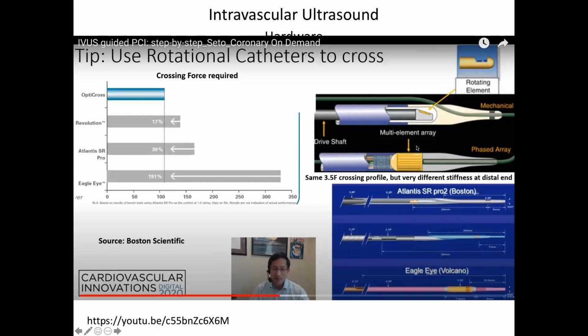And so here's 2 types of these catheters. One is you essentially have a fixed phased array of transducers that are on a cylindrical orientation, and you'll make pictures. You'll just go round and round that cylindrical orientation. And this is a more original way this was done, is that a motor just spins an inner drive shaft upon which the ultrasound transducer is sitting, and that thing spins around and just produces images as it's spinning around. And so you see these circular pictures around the catheter, and then there's a whole bunch of different types of these.